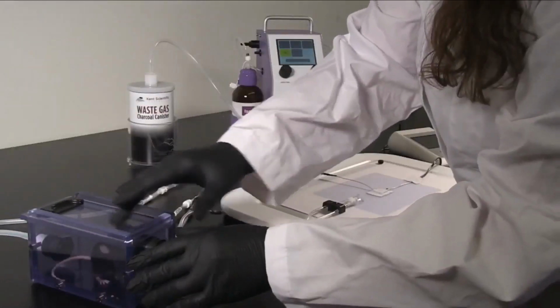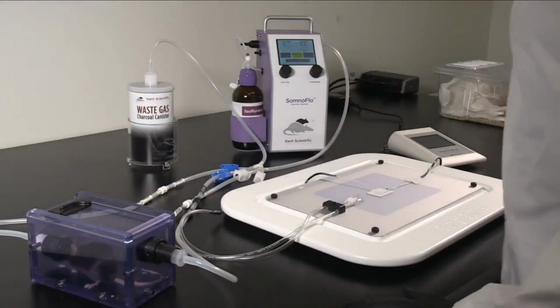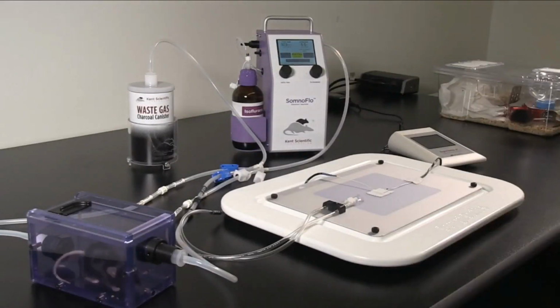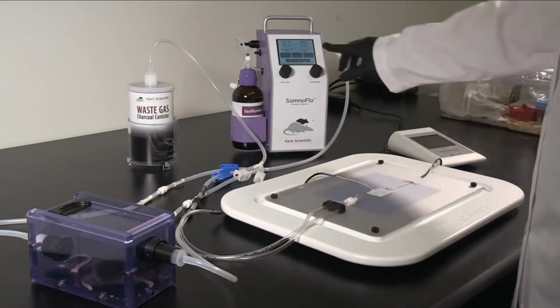Place the animal in the induction chamber and touch high flow. The SomnoFlow will begin delivery at the settings you've selected in your high flow presets. Use the dials to make adjustments to the flow rate or anesthetic concentration as needed. When the animal is fully anesthetized, touch high flow again to stop delivery.